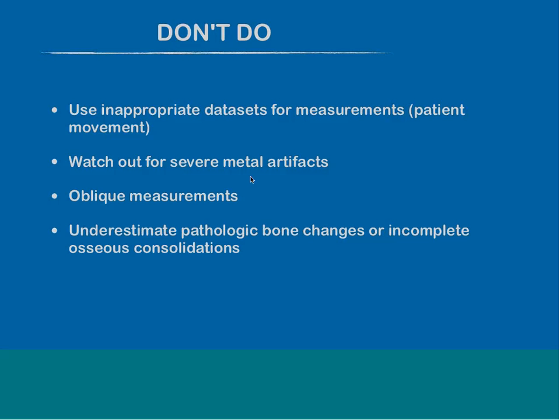Do not underestimate the pathologic bone changes I showed you, cementosseous changes, or even incomplete osseous consolidations, because these can be signs of some metabolic problems. These can be signs of improper bone biomechanical characteristics. So just check for these osseous consolidations.